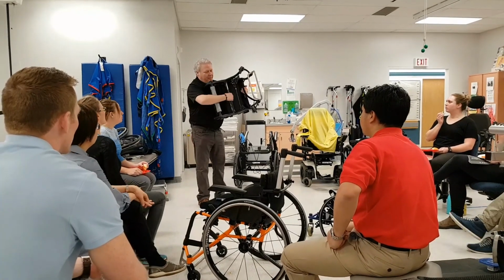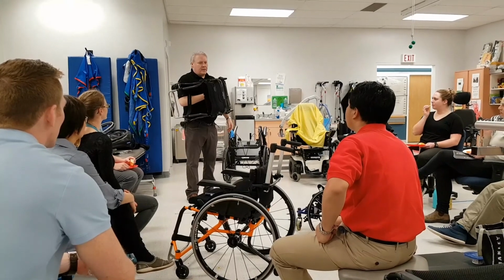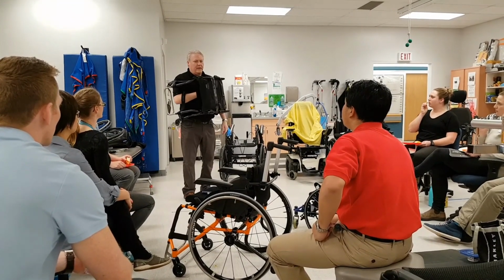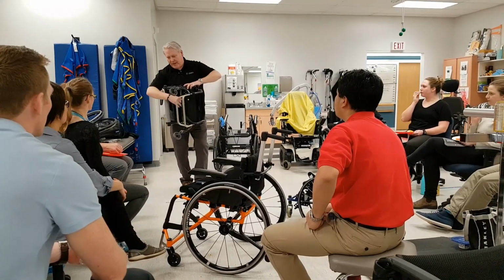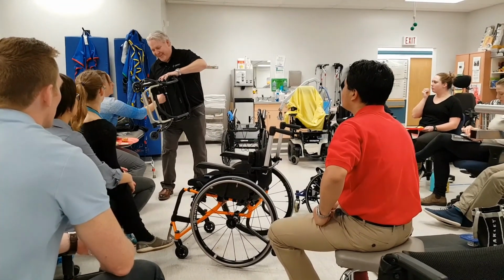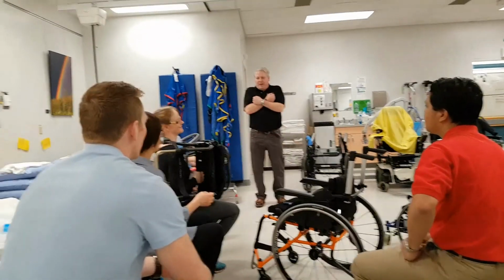So here's the frame, and this is where you pick it up by, and that's where the balance point is. Then it tucks right into your chest area, and you can pull it across your body and easily into the car. So I'll pass that around, so it's not heavy. Okay, and just feel how you bring it in.